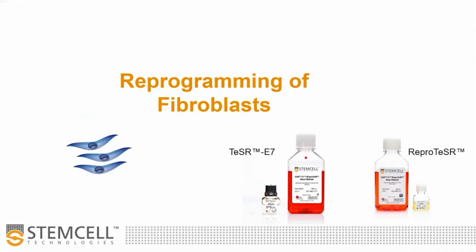And it was very useful for reprogramming. So when you take TGF beta out of TeSR-E8, you have TeSR-E7, and by the removal of TGF beta, you are promoting mesenchymal to epithelial transition, which is exactly what you want in reprogramming, and you're reducing fibroblast outgrowth, which is another advantage to reprogramming.